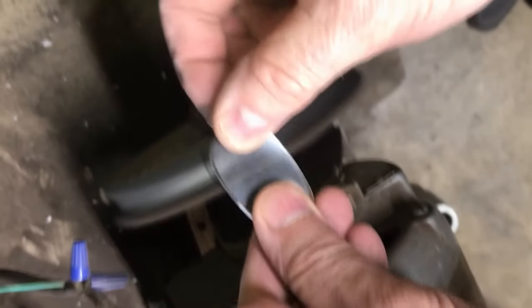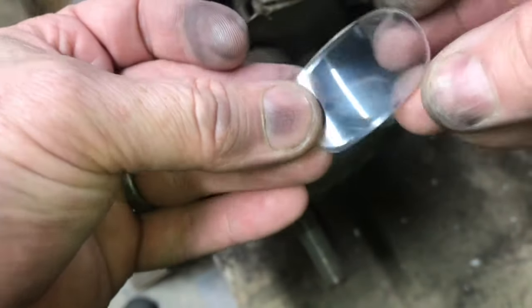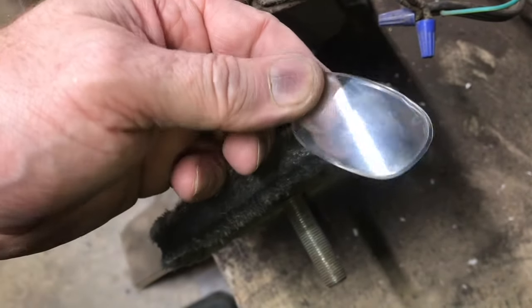Put some polishing rouge on and lightly buff the lens. You can see the scratches are a lot less, but you do have to be careful — if you buff too much, you could buff down some of the prescription. That's why you want to work with a pair of glasses that you don't care about first.